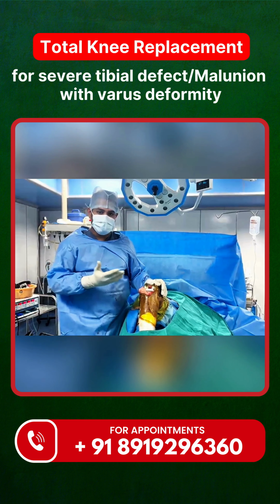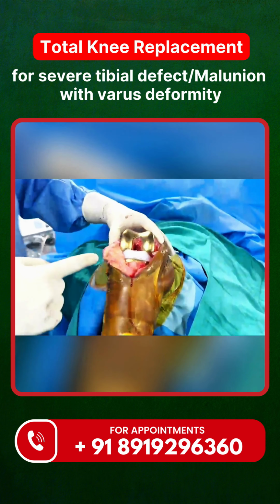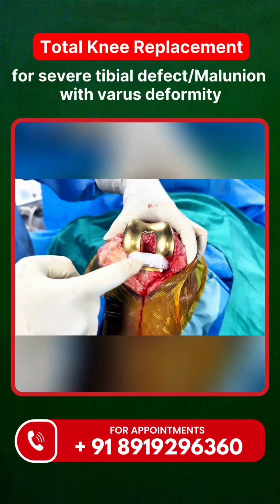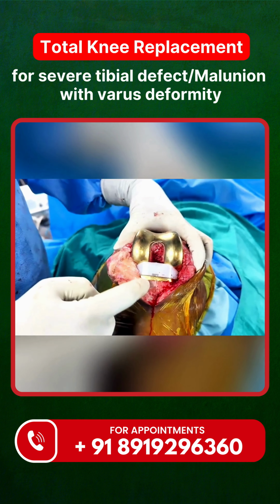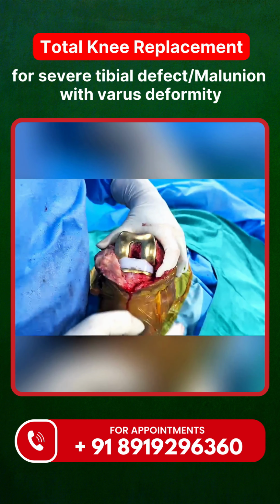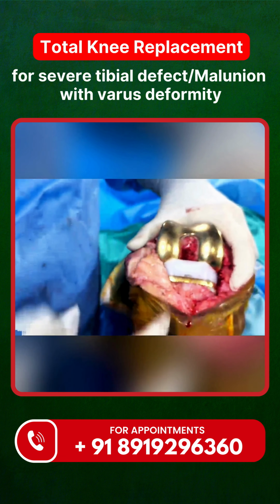So the implant of choice was Gold Knee. See, like you can see now, this is the femoral component, this is the poly, and this is the tibial component. We used very minimal cuts, mainly for the tibia, and the poly is size 7. You can see the cement that we have put over here. And we have used the extension rod.